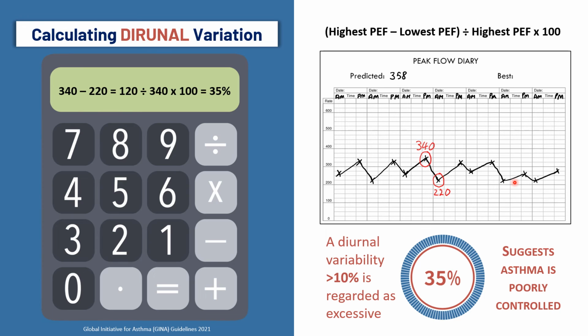Now then, if you give me inaccurate data, I'm going to make an inaccurate assessment of how bad your asthma is, and that might make me make decisions that are not in your best interest. The reason I'm telling you this is there's been lots of pieces of work done into this. In fact, in one piece of work that made me kind of giggle a bit, they put a secret microchip in peak flows, and they asked patients to record the peak flow.